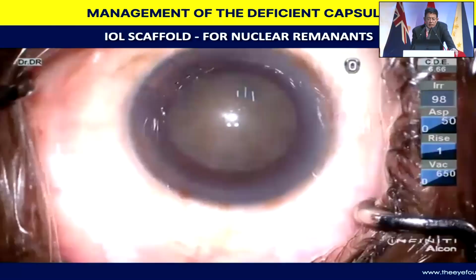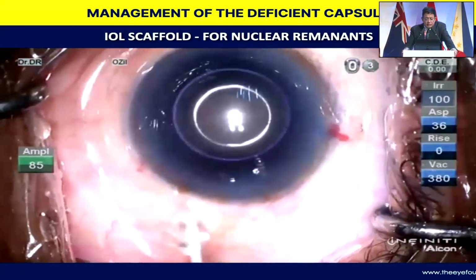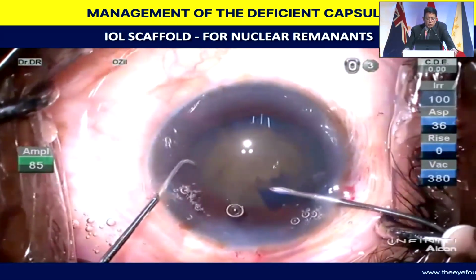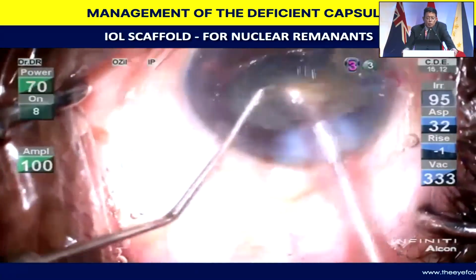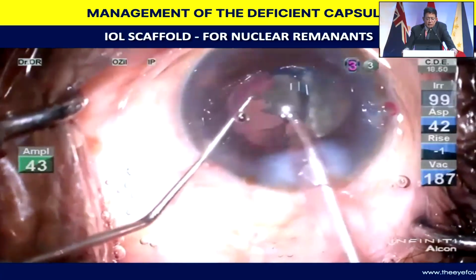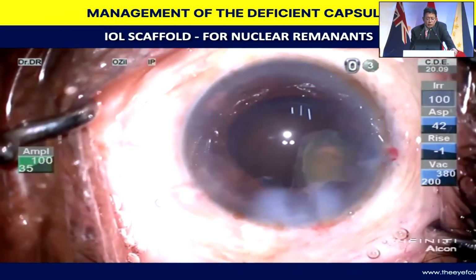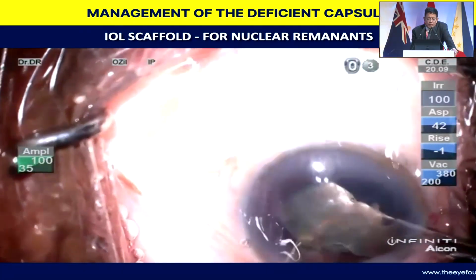And then in case you have significant nuclear remnants still there and your anterior vitreous face is intact, I found this IOL scaffold technique, which was essentially brought up by Amar Agarwal, to be quite useful. You can see the one heminucleus is being removed quite completely. But before I reach out to my second bit of the heminucleus, I find that there is a fairly large rent over there. So essentially what I do is to bring the second nucleus fragment into the anterior chamber. I'm maneuvering the nucleus fragment into the anterior chamber.